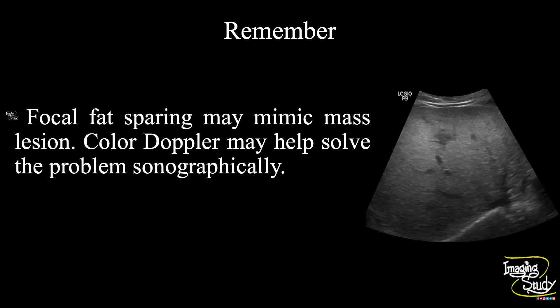The take-home message: focal fat sparing may mimic a mass lesion. Color Doppler may help solve the problem sonographically — a mass lesion will compress the adjacent blood vessels, whereas the fat sparing area won't disturb them.